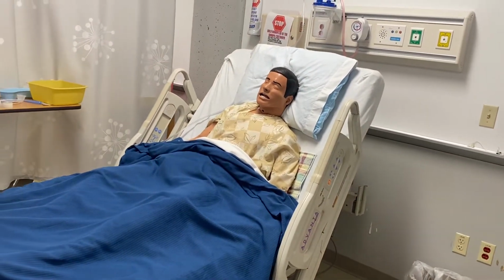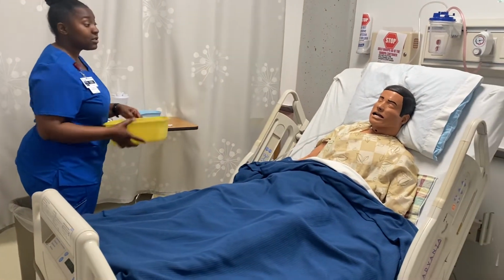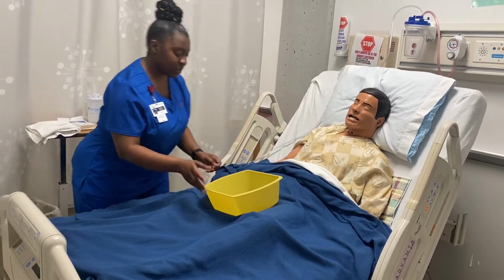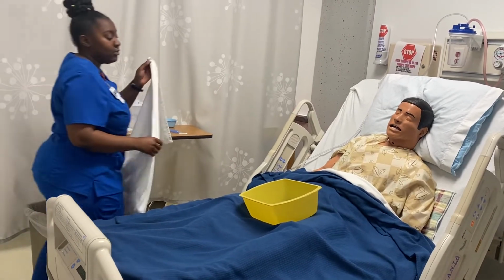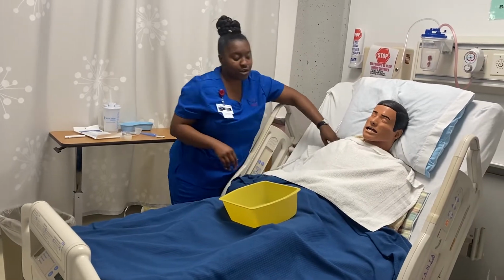Okay. So, before I start, just want to let you know what I have. I have the bucket. So this bucket will be for you in case you feel like you need to vomit. We'll set that here between the legs. Then we also have a towel for the patient. So during this, to make sure that there's no messes or anything, that it gets taken care of. I'll put this across your chest for you.